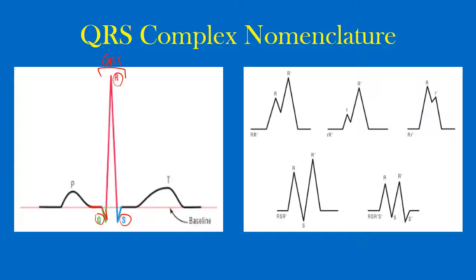So as you can see, the QRS complex is a combination of waves. The waves are named according to size, location, and direction of deflection. The tall or deep waves in the QRS complexes are given capital letters, while the small waves are given lowercase letters. However, this standard is not always followed, so don't be surprised if other books or instructors don't use it.